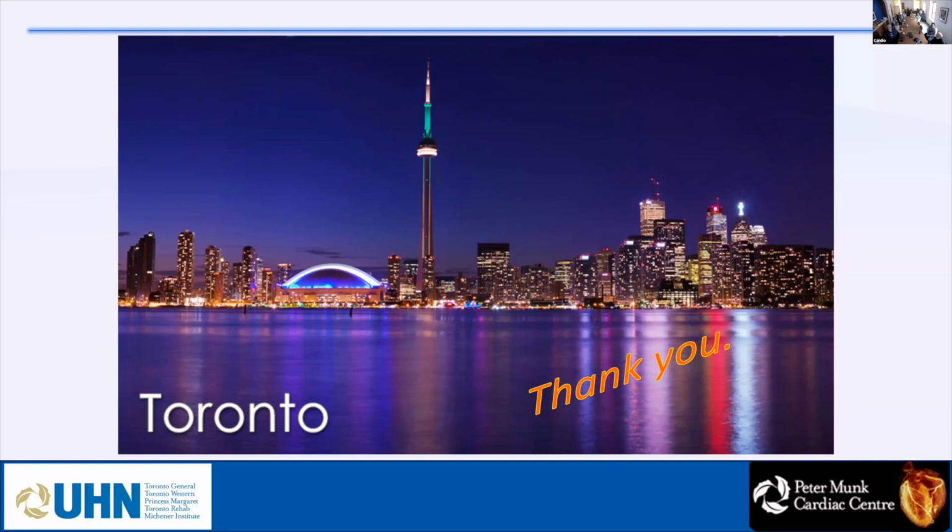I'm not trying to put us out of business, but can we have the measurement from the CT? Yeah, that's a good question. There is one center in Cleveland, because I talked with them. They do this CT before they come to the OR. Yes, we can have it. But you have to use the dynamic CT, and it cannot measure the leaflet as it opens and closes, as we do in echo.